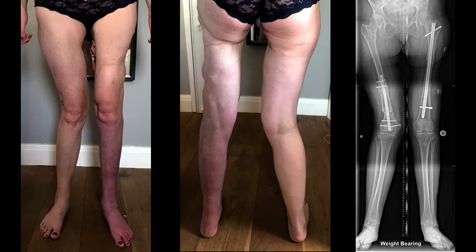At this point, she had a non-union, I think, at that level. But her operative management was somewhat delayed due to her becoming pregnant and not wanting surgery while she was carrying a child, and then COVID. So actually, you'll see that by the time we treated her, it had partially united. So this is where we started from.